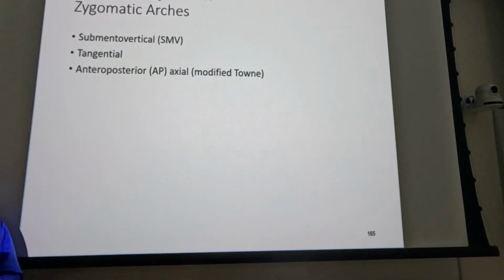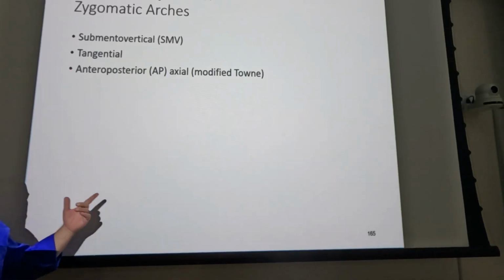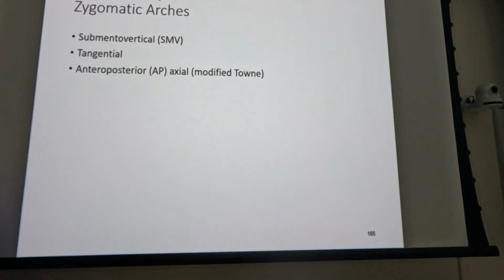So one difficulty that we run into with the zygomatic arches is that the arches don't stick out significantly from the side of the head, right? You're pretty well plumb here in most cases. Some people, their head is actually bigger than their face.